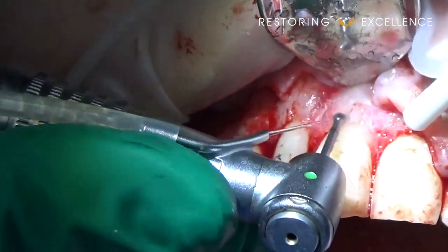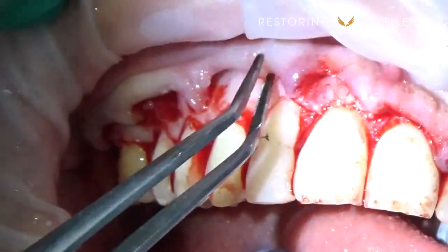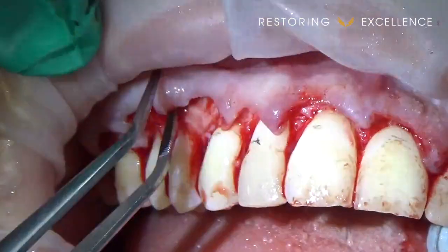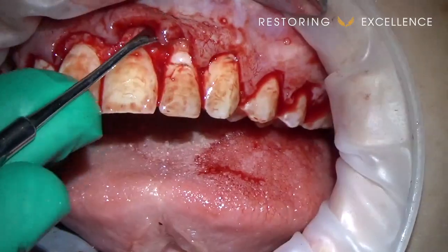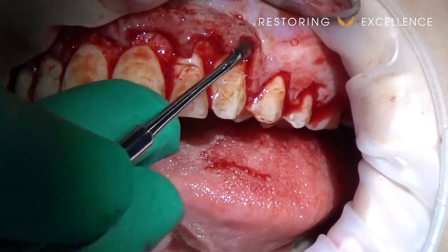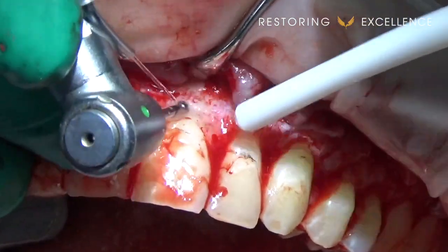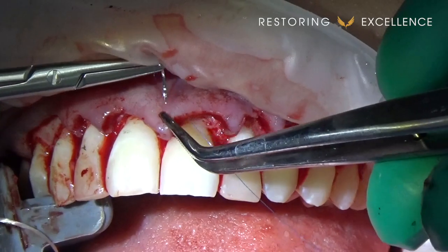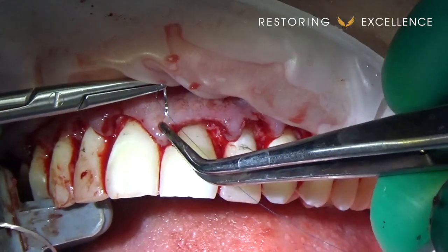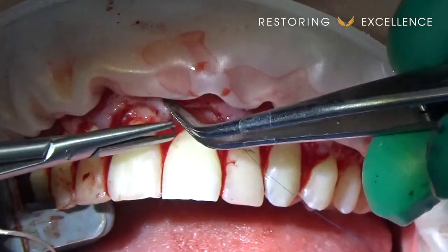It's very difficult to get the tissue to come down and meet the tooth properly if you have such large bulky exostoses. We're doing some bone removal around the tooth, basically just to give us two millimeters of root structure for the tissue to adhere to.